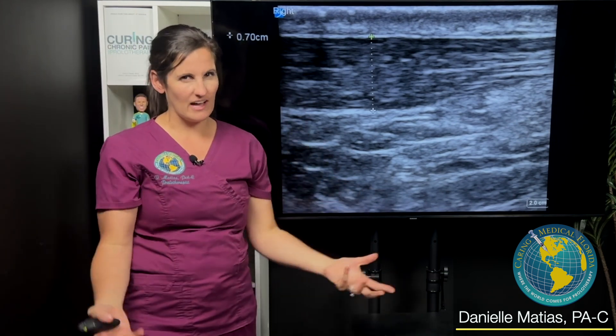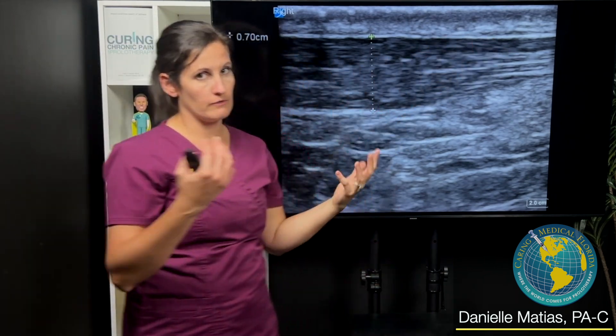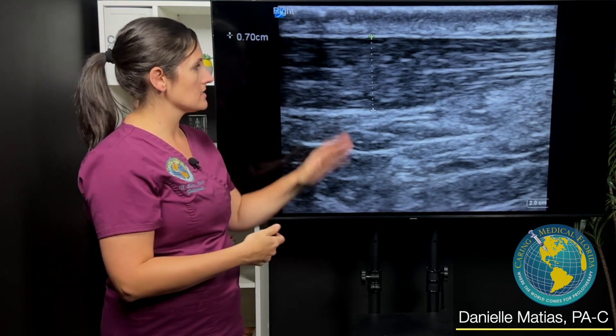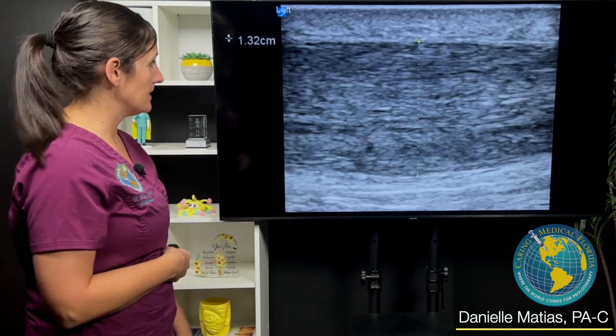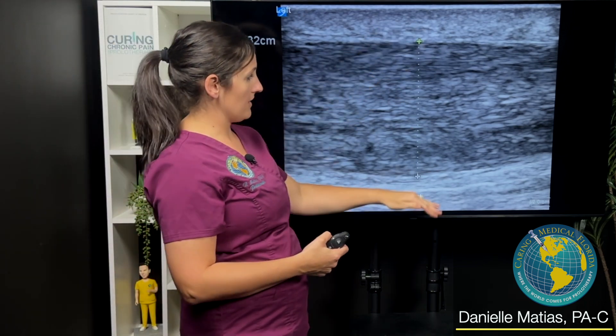Normally what we want to see in a healthy tendon is mostly bright white striations throughout, with minimal what we call hypoechoic or anechoic areas — meaning gray and black areas. This is his good side, and then just by comparison, here's his left. Pretty obvious difference — 1.32 centimeters is how thick this was.